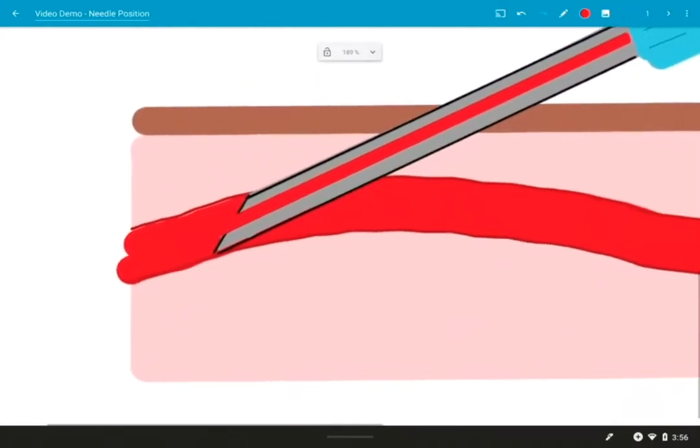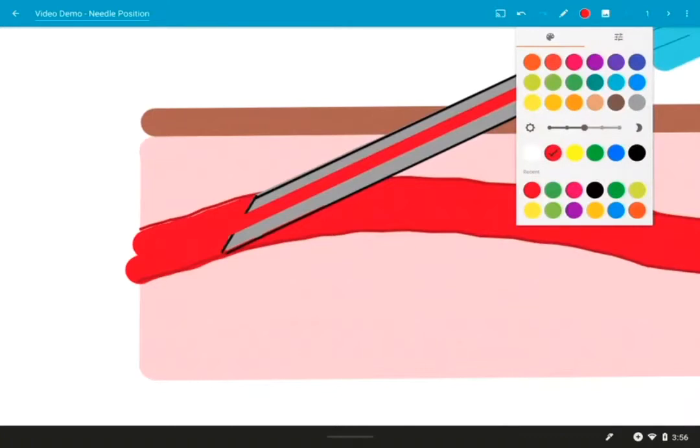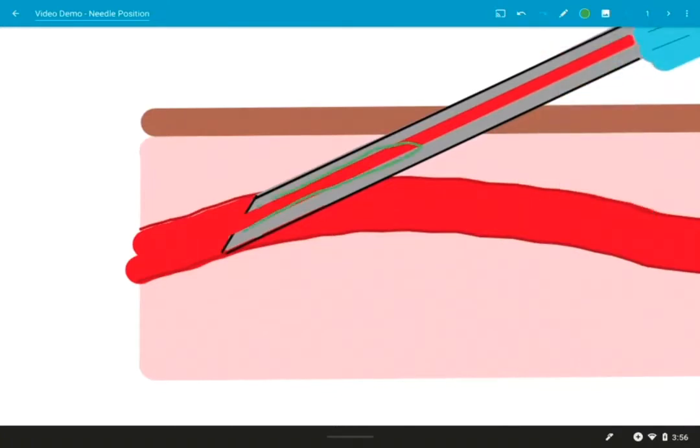So first of all, let's focus on this bevel here. The bevel is the opening to the needle, and the inside of the needle is called the lumen. You want that bevel facing upwards. You don't want to insert your needle the opposite way, so with the bevel facing downwards. This way you have the sharpest part of the needle, that point right there, entering the skin and entering the vessel and creating the least amount of tissue damage possible.